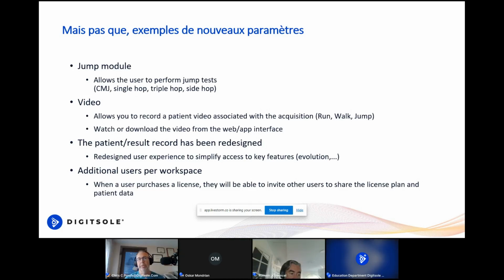They can visualize themselves in all of the data that we've been presenting in the analysis. We're also able to update some of the patient records and provide a better output and dashboard, making it more presentable to the patient, but also easier for the clinician to look at, evaluate, and export some of this data.